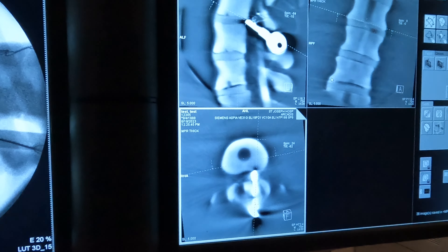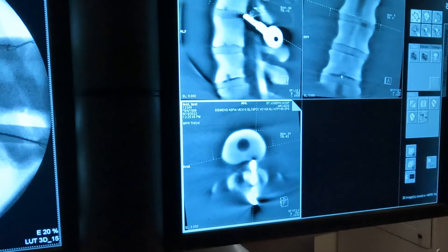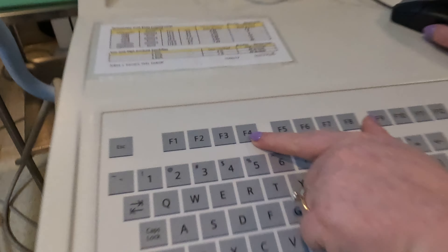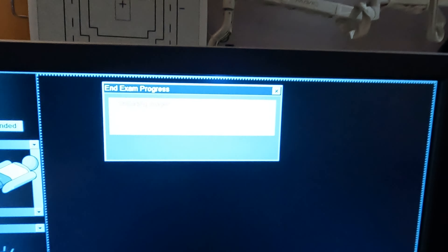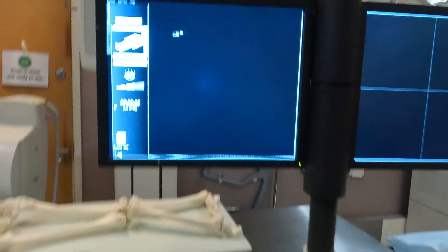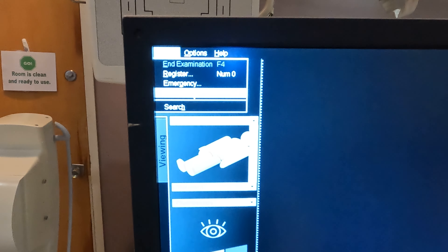Now that everything is saved, the spin is usually at the end of the case. Move the C-arm out from around the body, and the way to end the exam is by pressing F4. Once you click F4 it ends the exam and uploads all the images, and it'll go back to the beginning screen. Hover over to the left corner, click patient, and this is how you send.